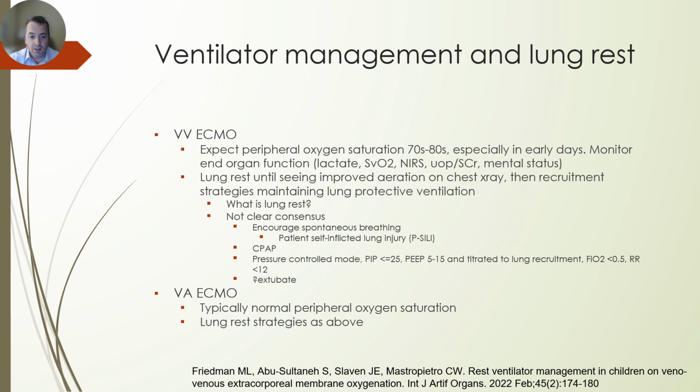There's not clear consensus. Some encourage spontaneous breathing, but there's a new term called patient self-inflicted lung injury, or P-SILI, which is when patients in dyssynchrony with the vent and who have significant lung injury take deep inspirations, and those attempted deep inspirations can cause additional lung injury.